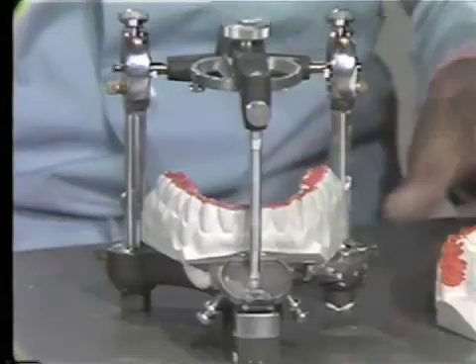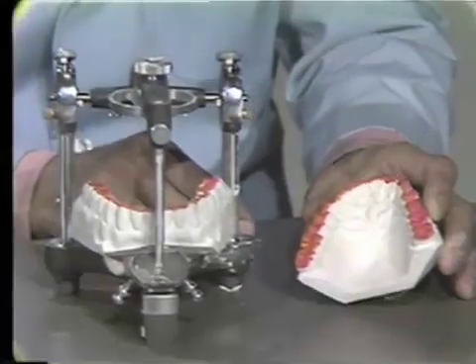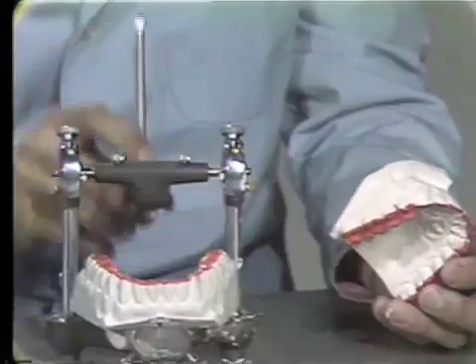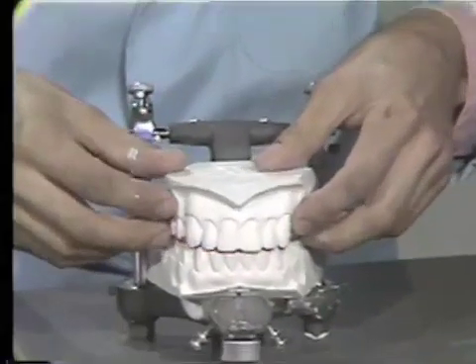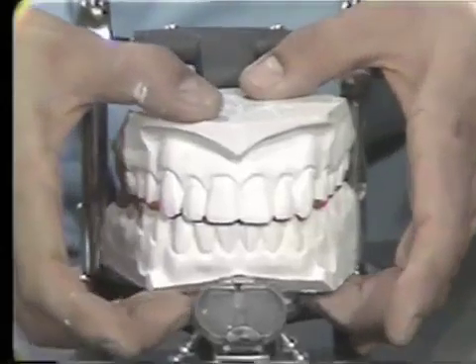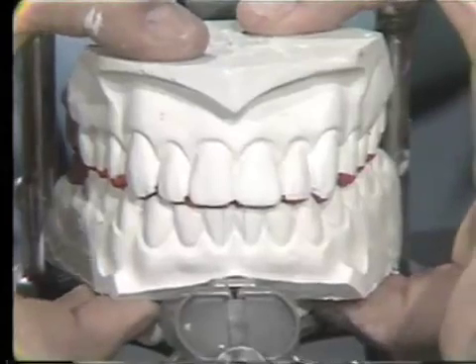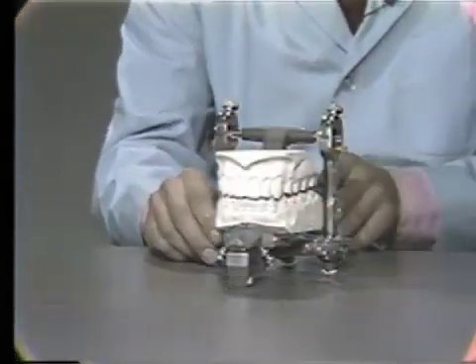The next step is to mount the upper cast on the articulator onto our pre-plastered lower. It's very critical how it fits together. You want to get this upper model on the lower model in such a position that there is no rocking when you squeeze on the front and the back. You can see right here there's no rocking on this cast. That is the correct position that we want this model mounted.